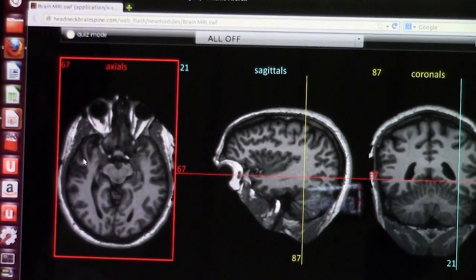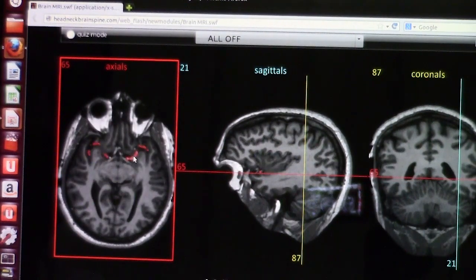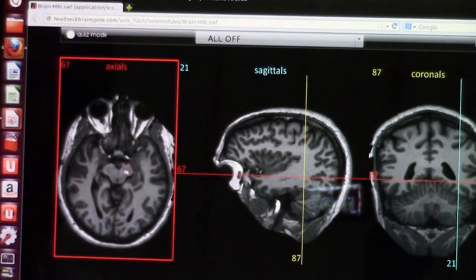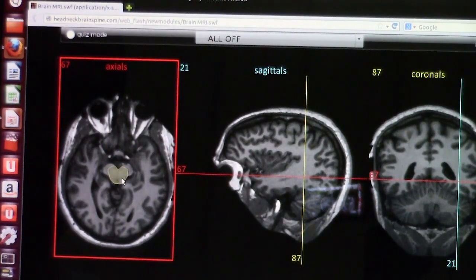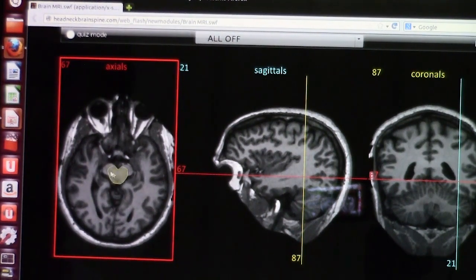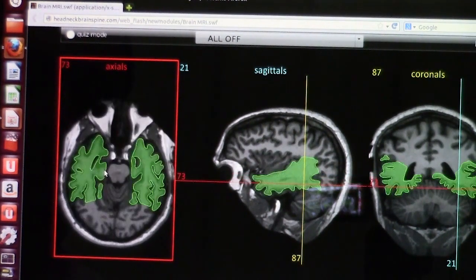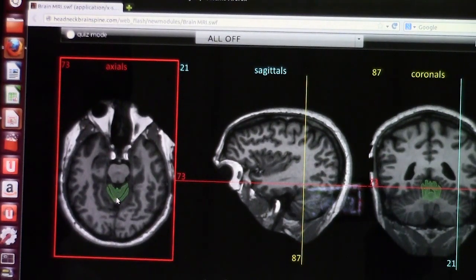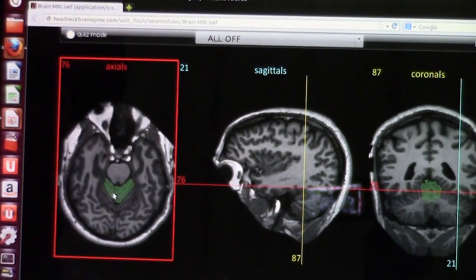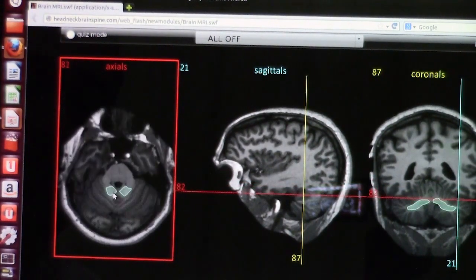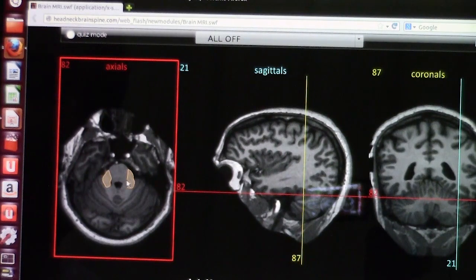As we go down, you can see the middle cerebral artery. The Mickey Mouse appearance here represents the cerebral peduncles attached to the midbrain. This bridge structure is called the red nucleus. As you go further down, the cerebellar lobes start to appear as horizontal lines, and here we are seeing the pons and the middle cerebellar peduncle.